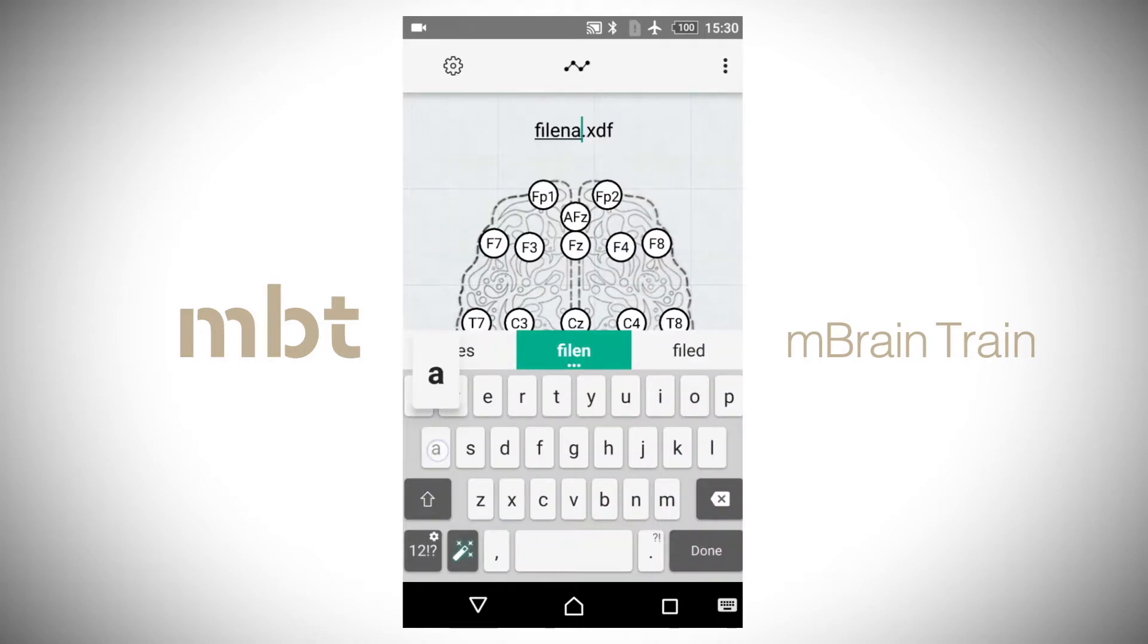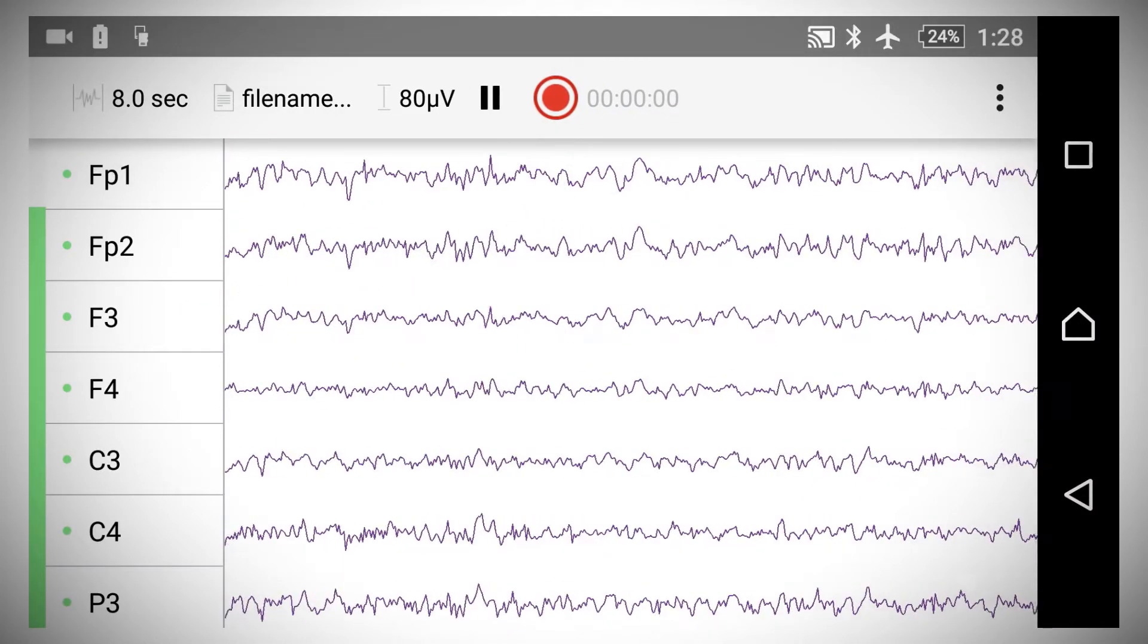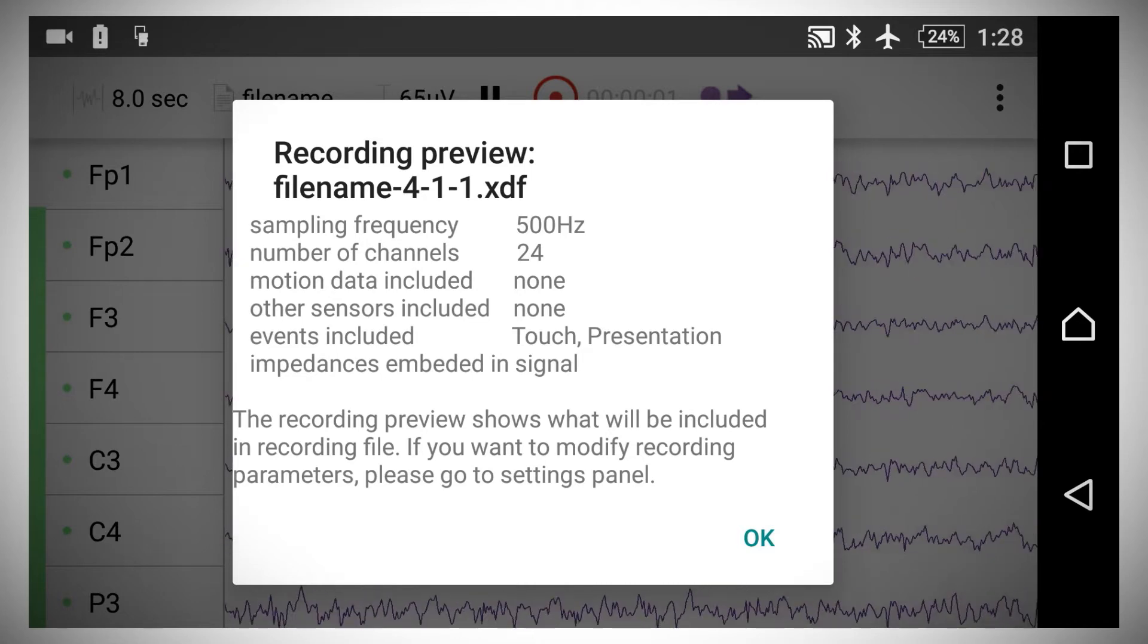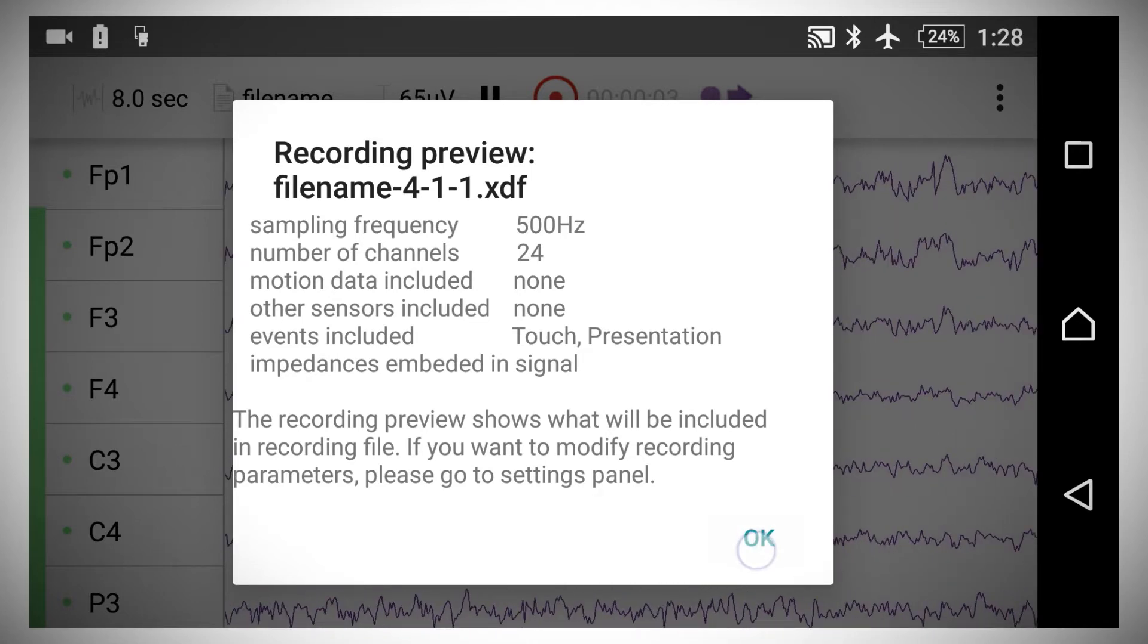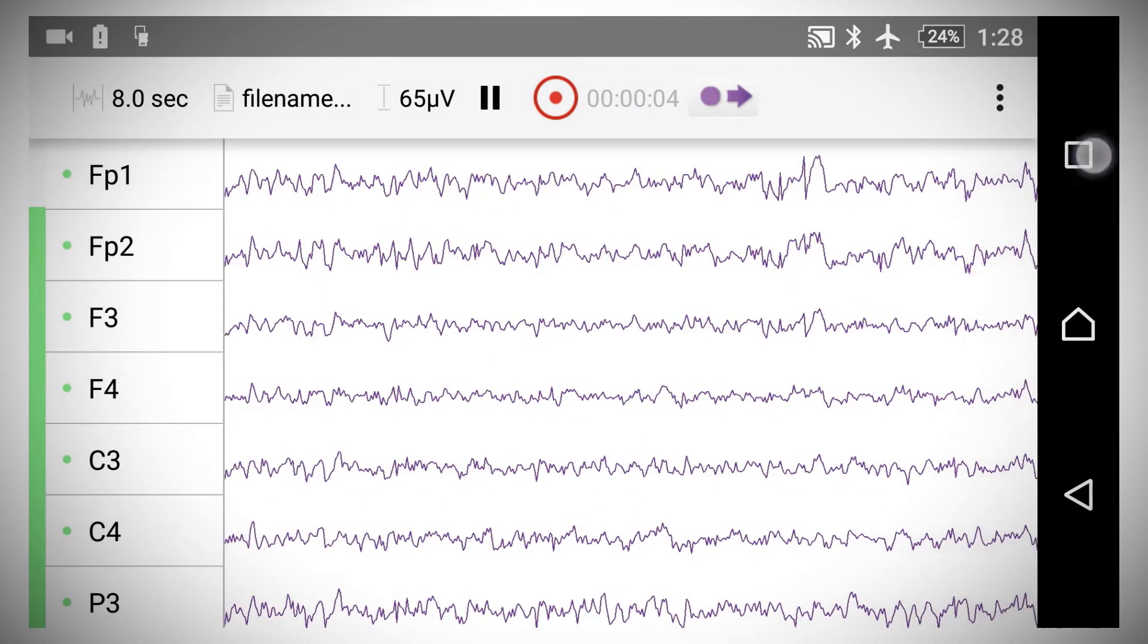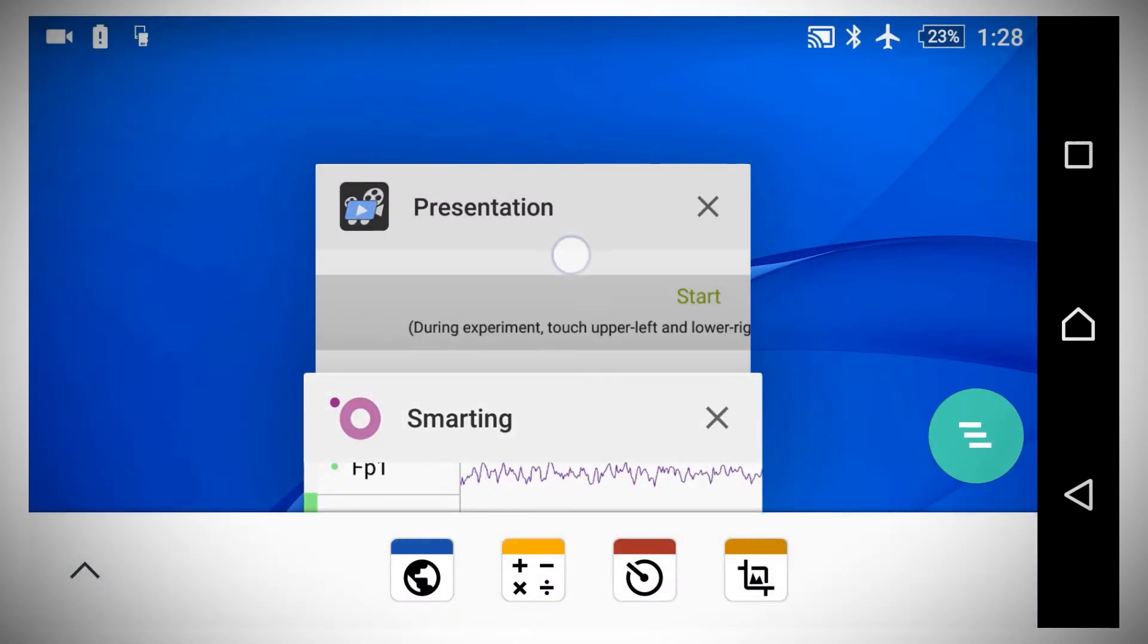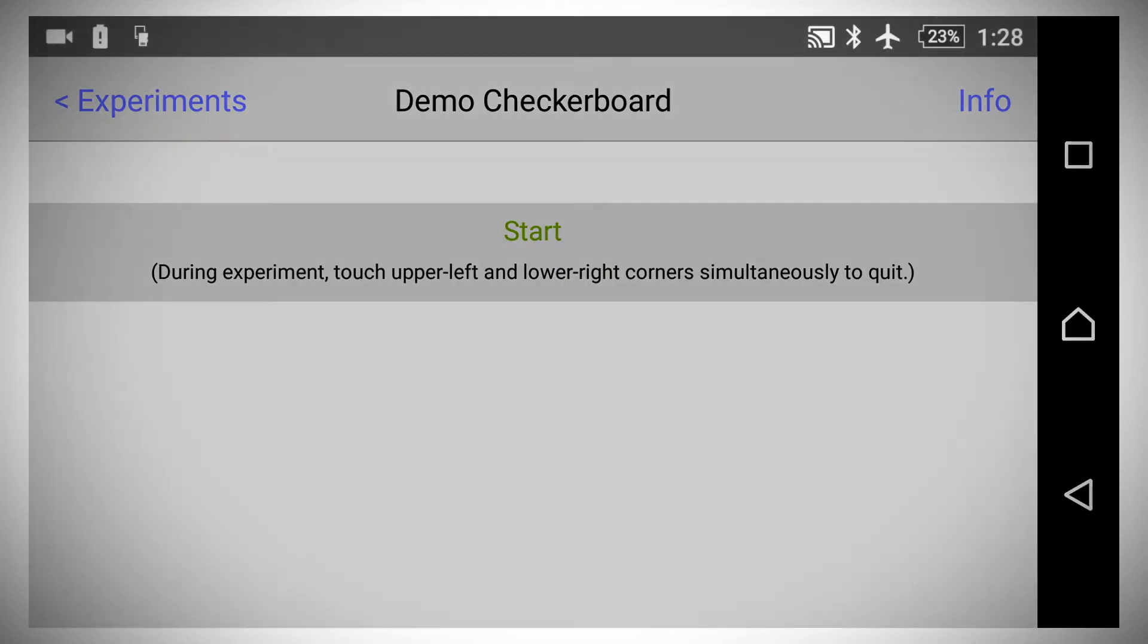Go back to the main menu and provide the desired file name. Go to the Signal Show window, click the Record button and carefully read the recording preview. To start the experiment, press the smartphone square button to return to the Presentation app. In Presentation, click Start the Experiment.